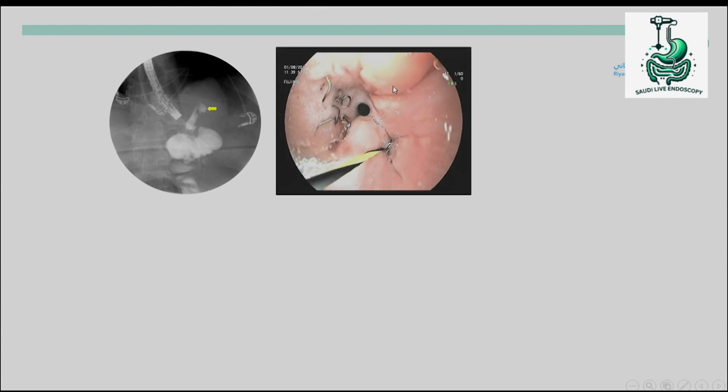For example, this is an example of a patient also with a leak post-gastric bypass. Here, this is the view in the lumen. Actually, this is the lumen, which is apparently very stenosed, and this is the leak. Now, we know from the basic surgical principles, if you have a distal obstruction to a fistula, it is one of the major causes that will stop the healing. So no matter how many pigtails you put in this hole, as long as the pressure is high below, then it will never heal. So in this case, you can't just put an endoscopic internal drain.